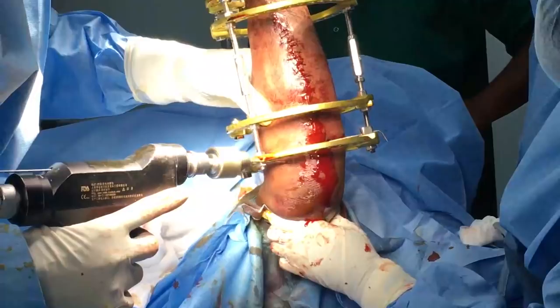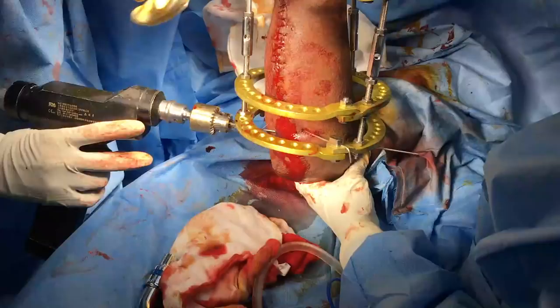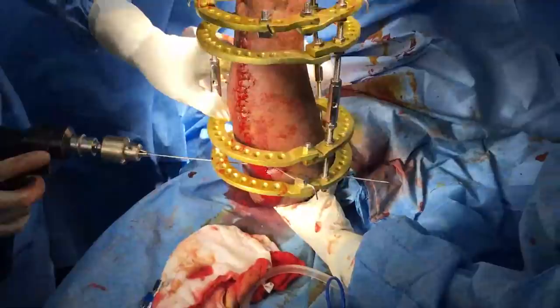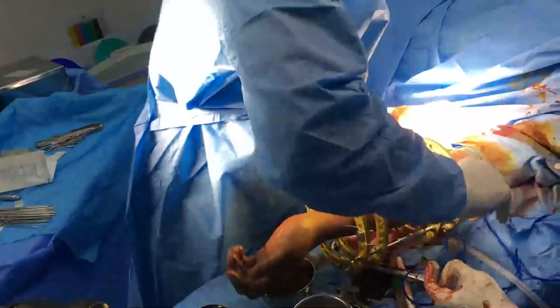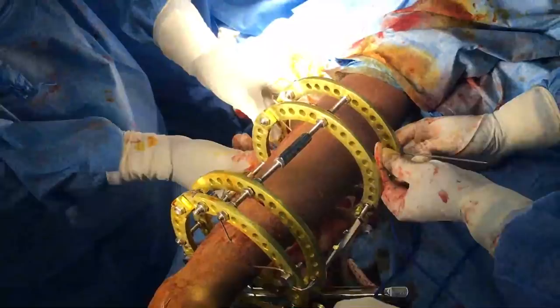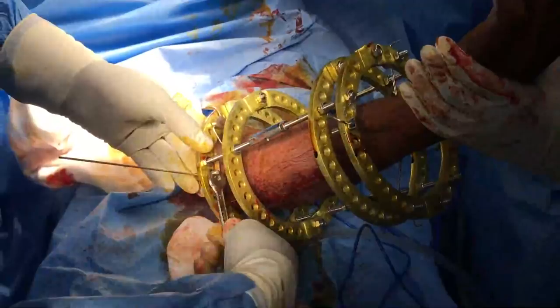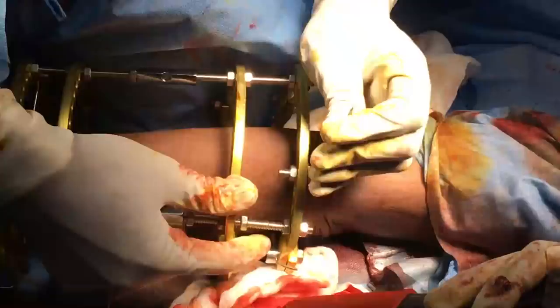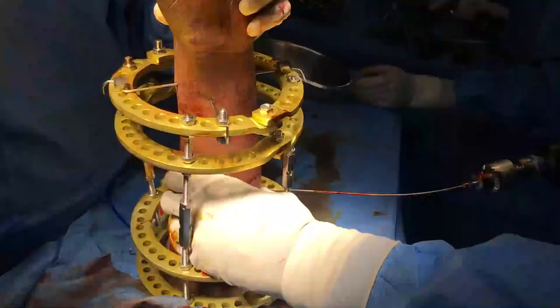In upper rings, we do not need more than 100 to 120 kilograms of tension for the wires. The second wire is a medial-lateral ulnar wire again. Once the most proximal and most distal rings are fixed with right-angled wires, we move the forearm from full extension to flexion and full supination to pronation to ensure that all movements are free. This confirms that the wires so far have gone in precisely perfect corridors.